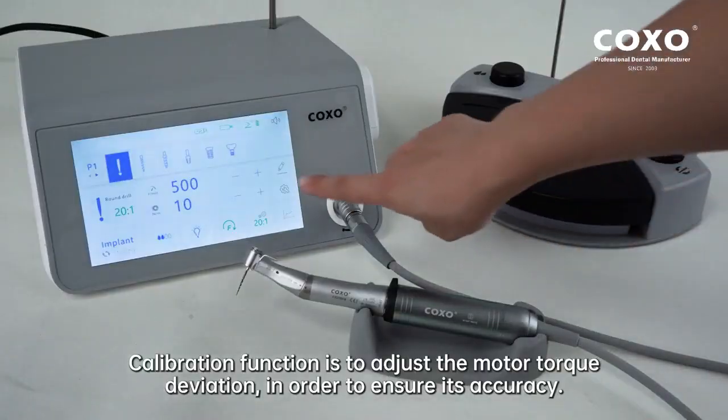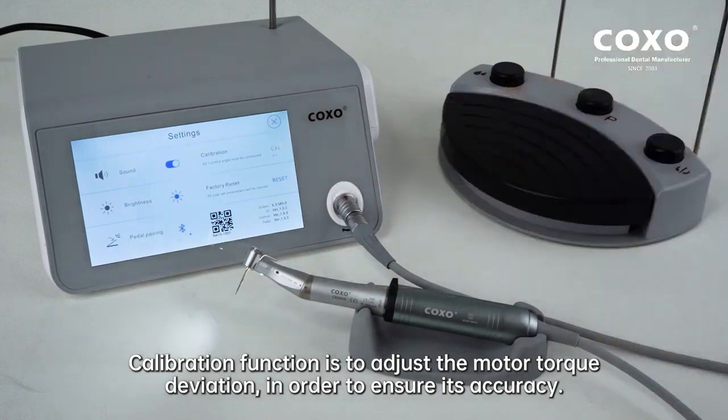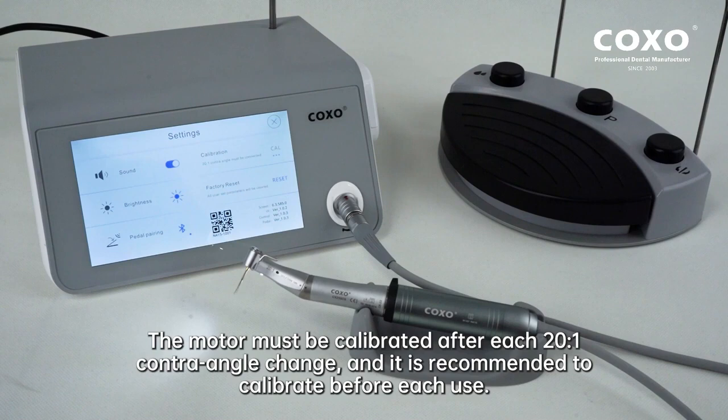Calibration function is to adjust the motor torque deviation in order to ensure its accuracy. The motor must be calibrated after each 20:1 contra-angle change, and it is recommended to calibrate before each use.